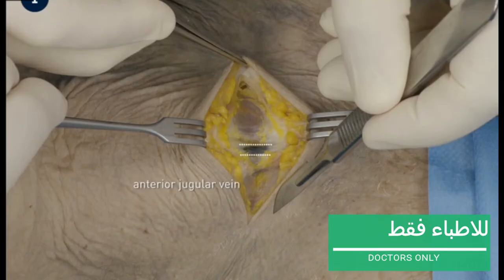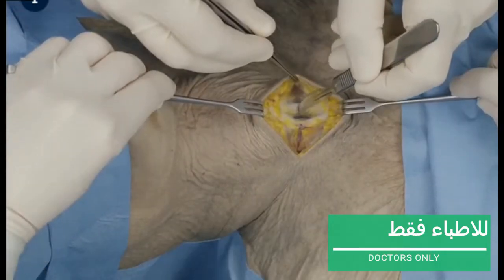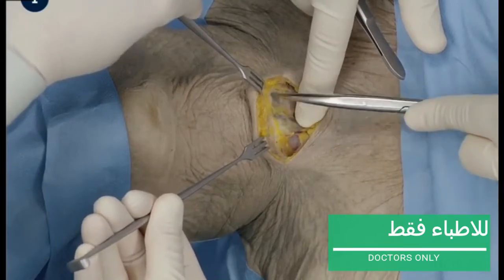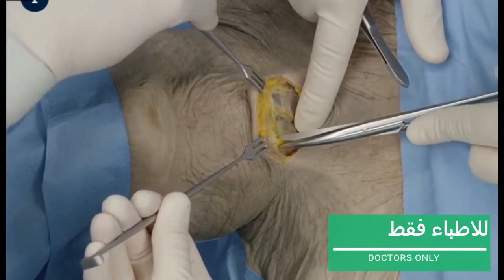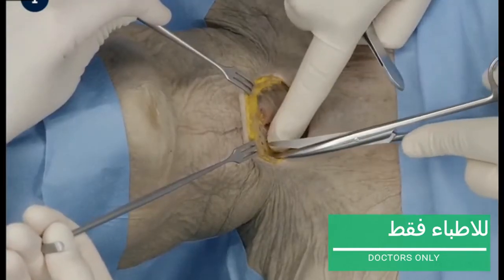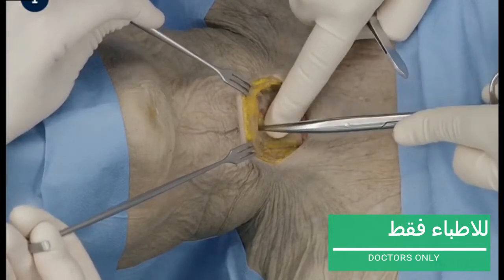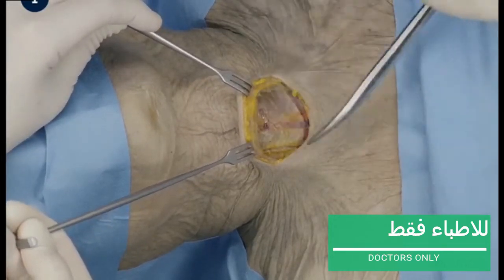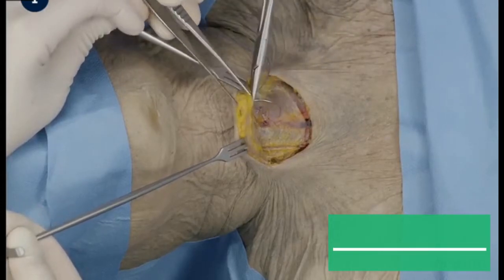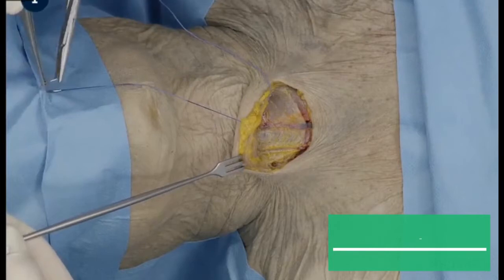The subcutis and platysma are incised, then the skin flaps are created. The upper flap is dissected until the hyoid bone is reached, which is pointed out here. Sutures can be used to fix the skin flaps through the surgical drapes.